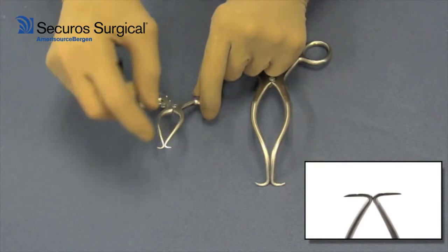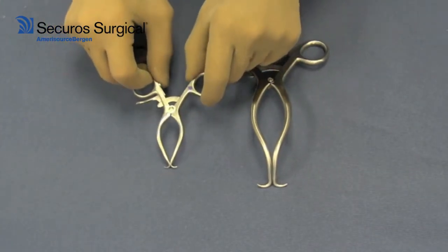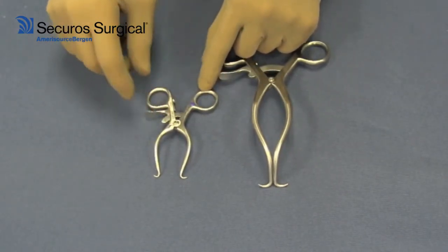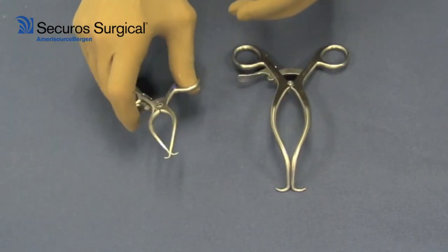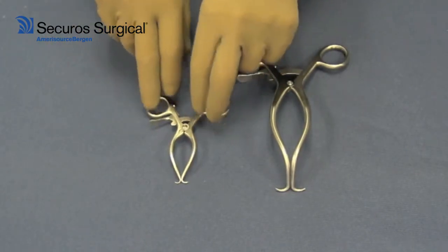As you close the handles, they are self-retained by the ratchet near the lock box, so they are operated with a single hand — an exceedingly valuable instrument in your surgery pack.